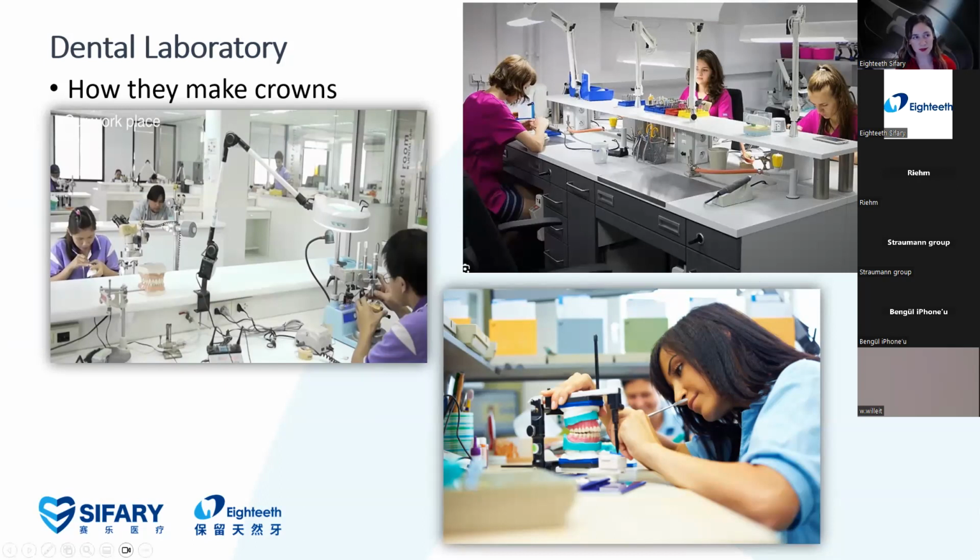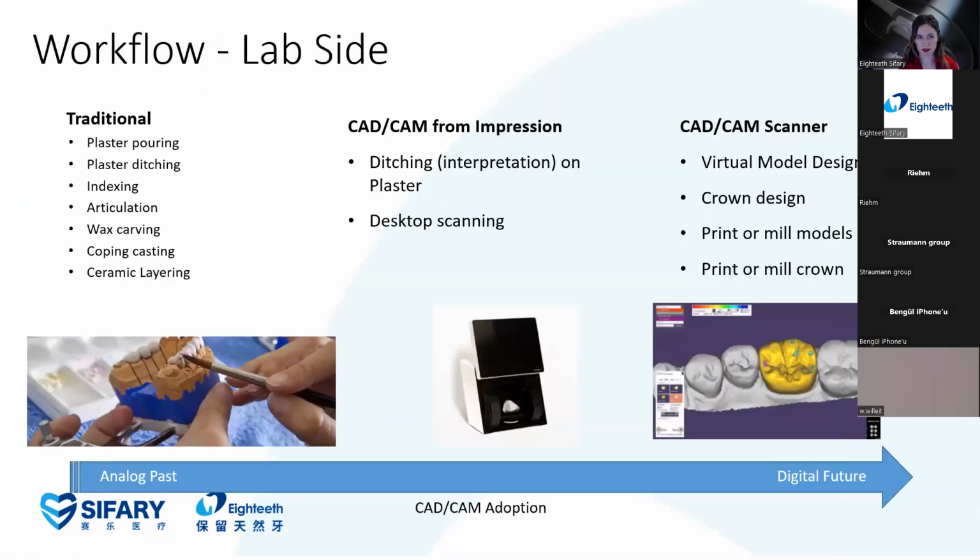But let me explain the workflow on the laboratory side. In the traditional workflow, they have to make a lot of steps in order to take an impression and do their desktop scanning. As you see in the middle, instead of an intraoral scanner, there are some devices in order to take the model and work on that.